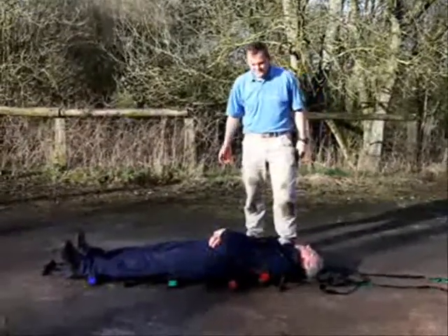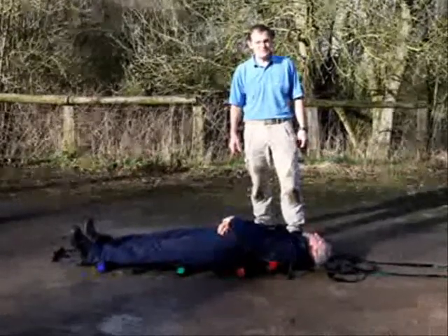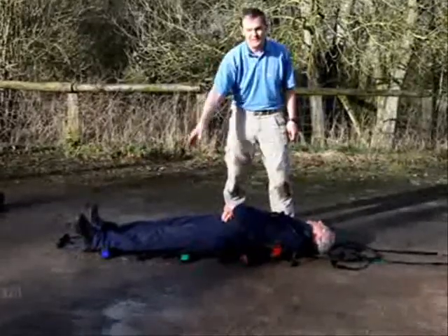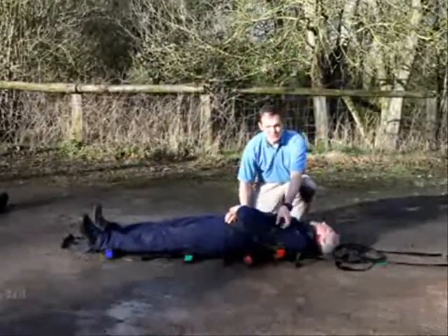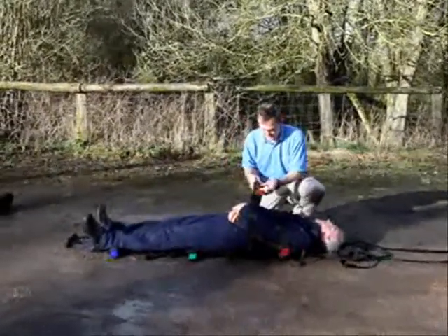Once a casualty is in a place of relative safety, we can secure them a bit better onto the teammate with the straps. You'll see the straps are colour-coded — red, orange, green and blue — a bit like traffic lights. The first strap, the red one, goes under the arms so the patient is secure if we're going up or down a hill.